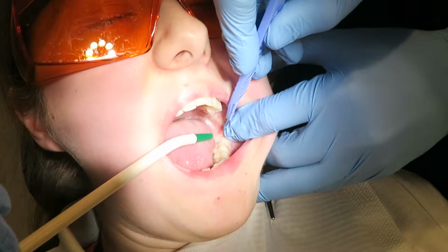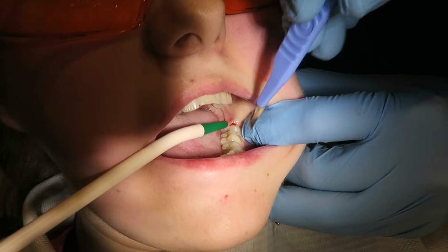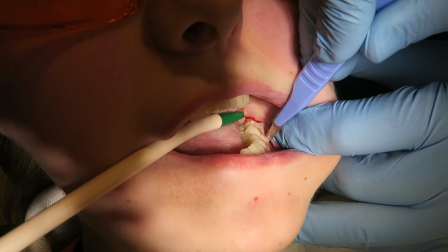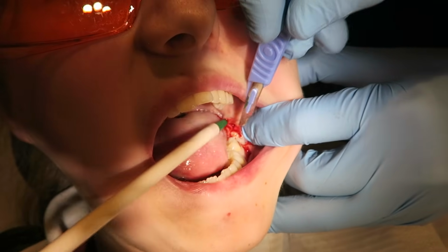Now raising the flap, as you can see, I'm using a number 15 blade, starting by making a distal relieving incision. You have to stretch the tissue to cut through the tissue neatly, and to make sure that you cut at right angle to the bone, and make sure it's a full thickness mucoperiosteal flap.